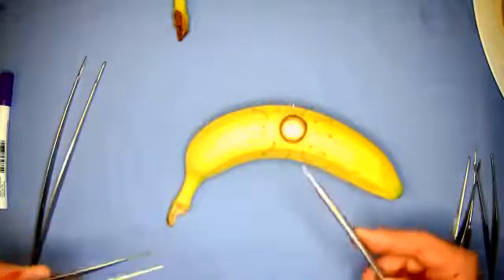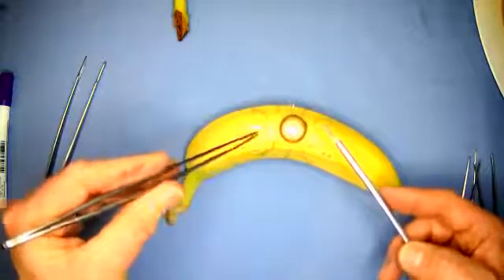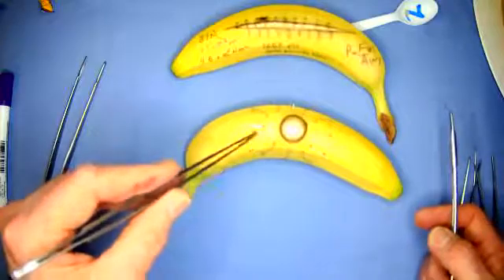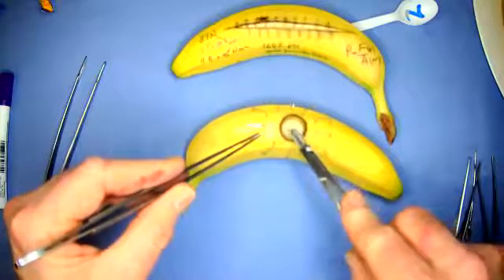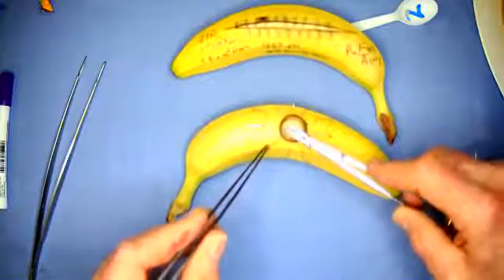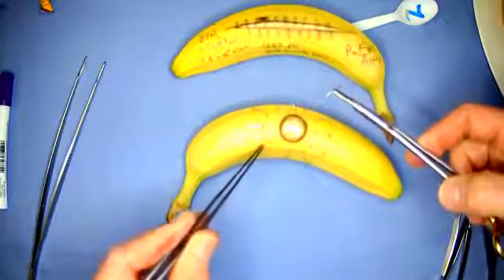The other common mistake I find when people are operating is that as they focus on the operating hand, this not only grabs and pinches, as I've demonstrated, the damage, just to remind you, simple physics there, but also drifts and drags. So what I've done here is put staples in the banana, and as I go round, I need to hold the respective staple in turn without delivering the needle, and without pulling or dragging or moving my staple. Because what I often find is as people are focusing, this drags and drifts.